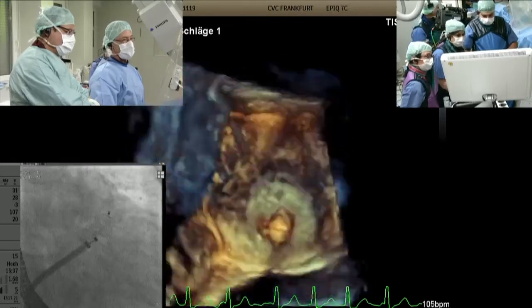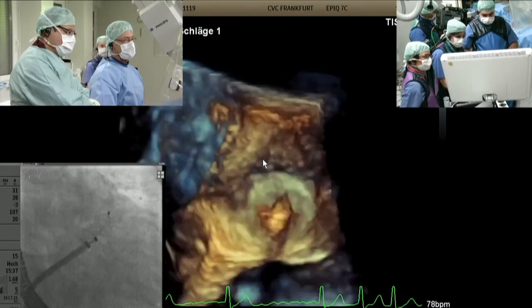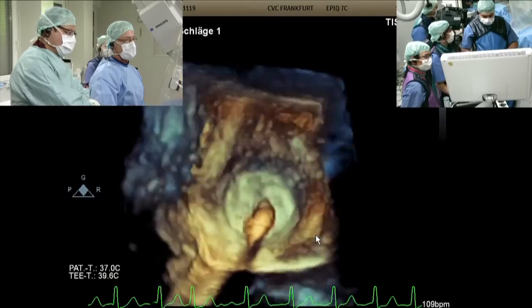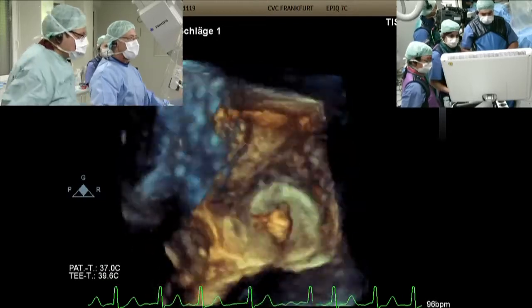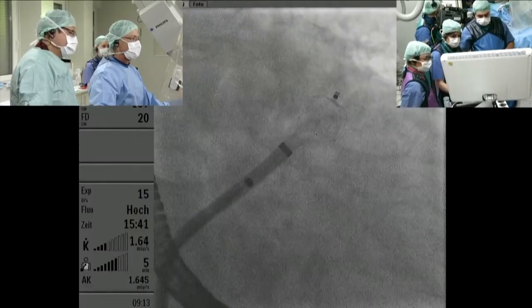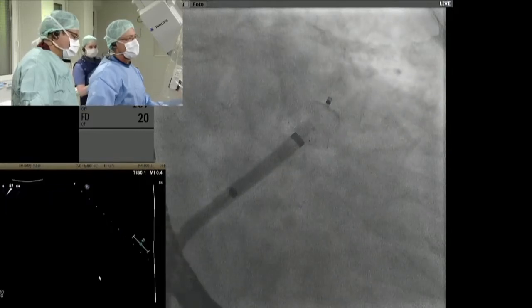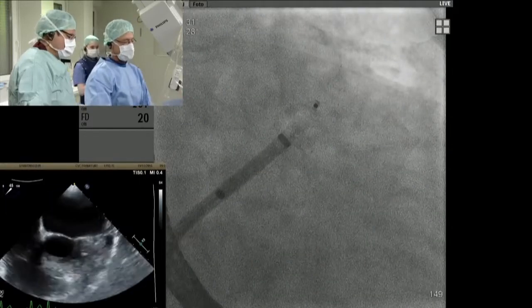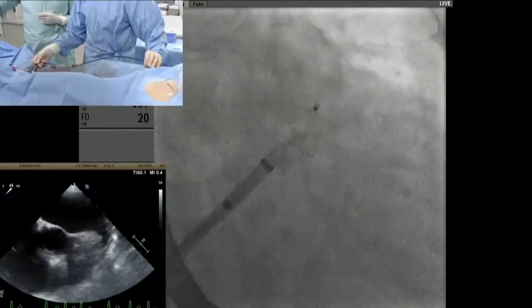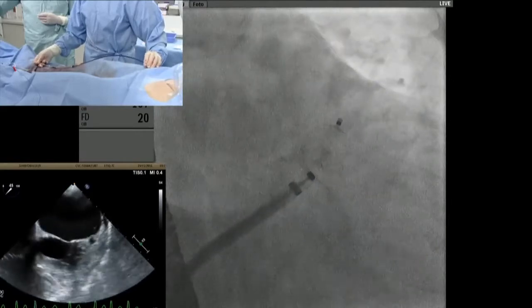Do you agree? So we've got an inferior lobe that's uncovered, and then along and above it, we've got a disc that isn't covering the whole of that landing zone. Okay. And it's unpredictable what happens when you're going to... Yeah. But Horst has pushed, as I saw correctly. Yeah. Well, I did both. I did not fall in. So for me it would not fall in. Okay. It doesn't fall in, but also it does not cover the leak when I push.